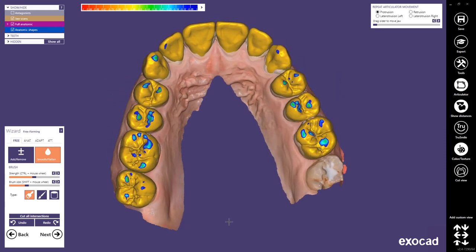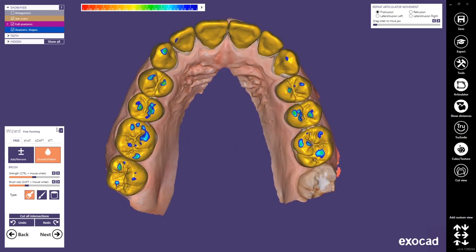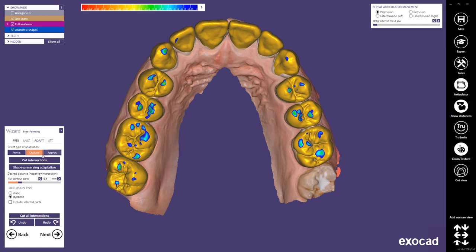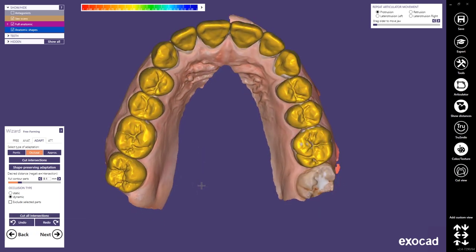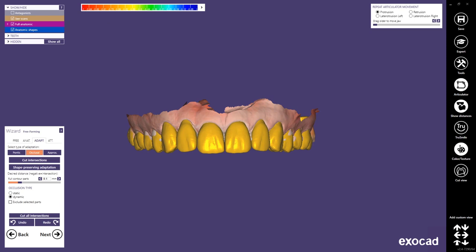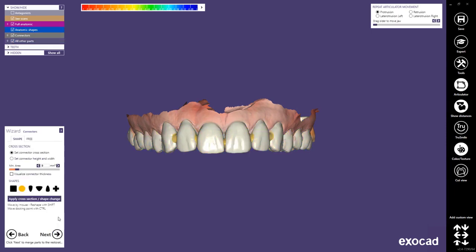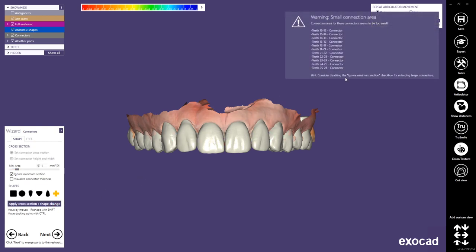When you are done with freeforming it is time to switch to the adapt tab to adapt the occlusion. In this step you should only adapt the occlusion and ignore the pontics or the proximal contact points. You can select between the static and the dynamic adaption, but don't press cut all intersections. Since the pontics are still intersecting the natural teeth any other adaption would hurt the design — we will adapt this later in the partial framework software. For now just click next. The thickness and shape of the connectors is not important in this case, so we select tooth-to-tooth adaption and just adapt them, giving us one complete object. Then we click next again.